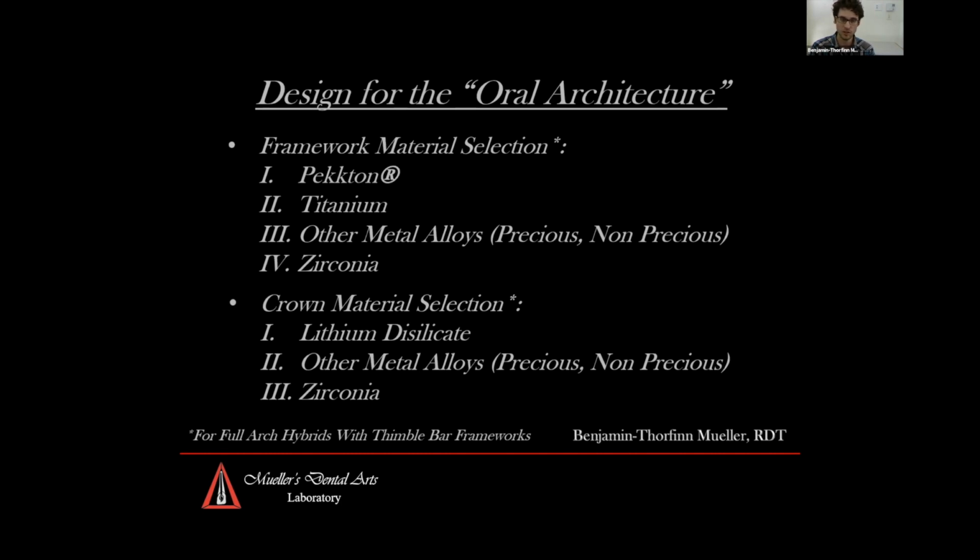Again, it's a very rigid material. All occlusal forces get transferred immediately to the implants. We've seen other cases come into our lab from elsewhere that, after 5 years, have severe wear where porcelain has sheared or fractured off, or the zirconia frame itself has broken because it couldn't withstand the constant abuse of the occlusal forces. And in the worst case scenario, even peri-implantitis, where implants start to fail because nothing is safeguarding anything. So just things to think about.